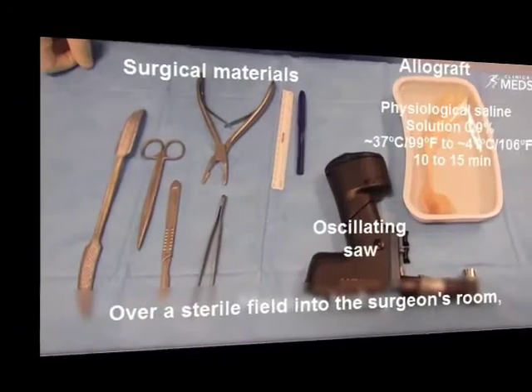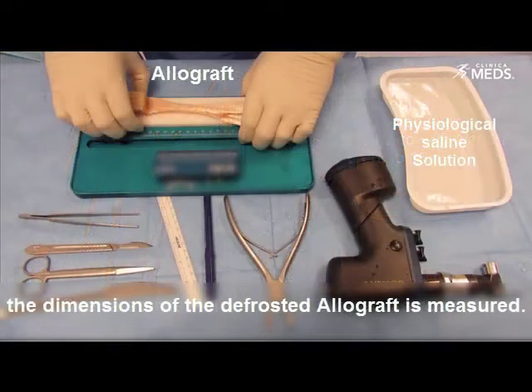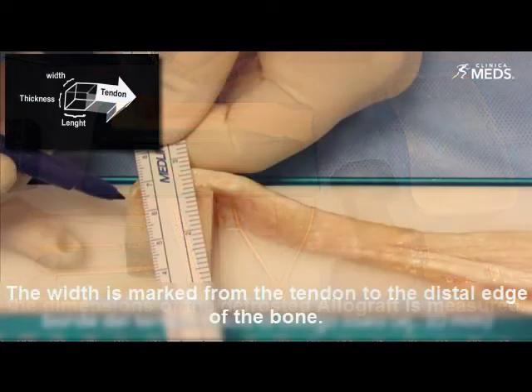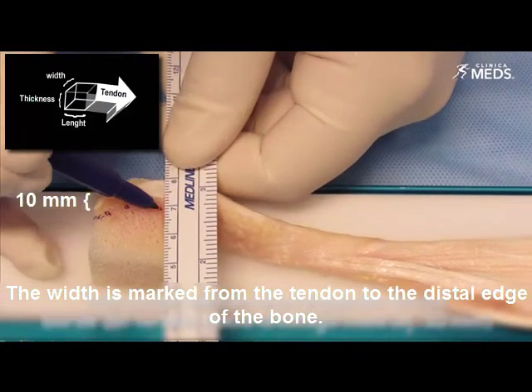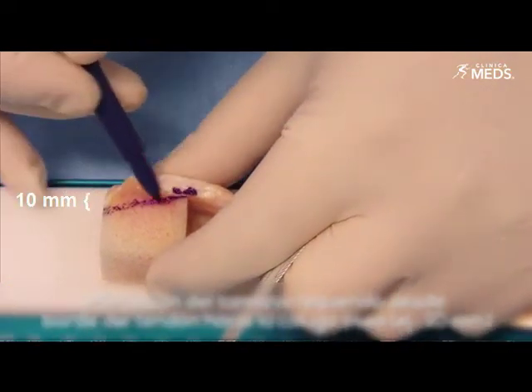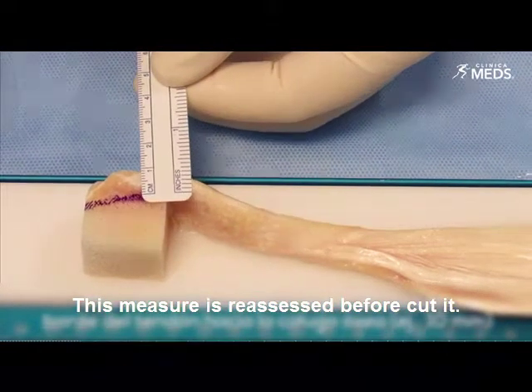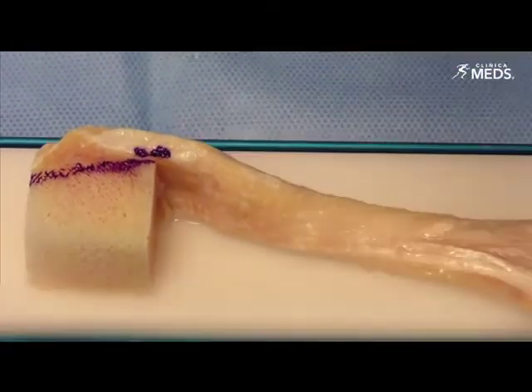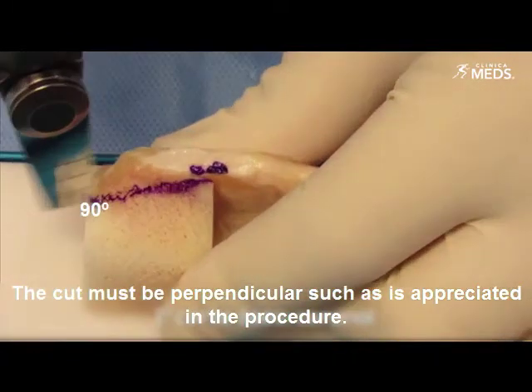Over a sterile field in the surgeon's room, the dimension of the defrosted allograft is measured. The width is marked from the tendon to the distal edge of the bone. This measure is reassessed before cutting. The cut must be perpendicular, as is appreciated in the procedure.